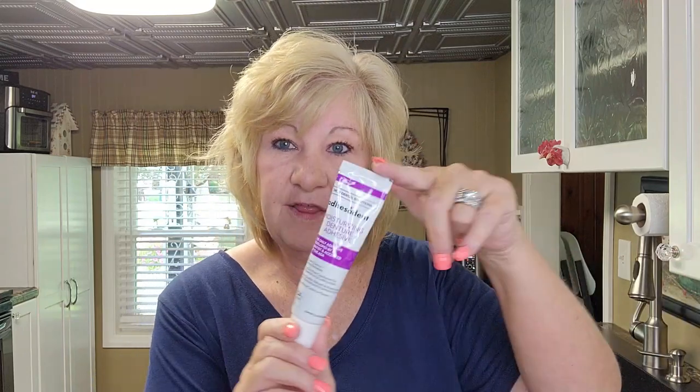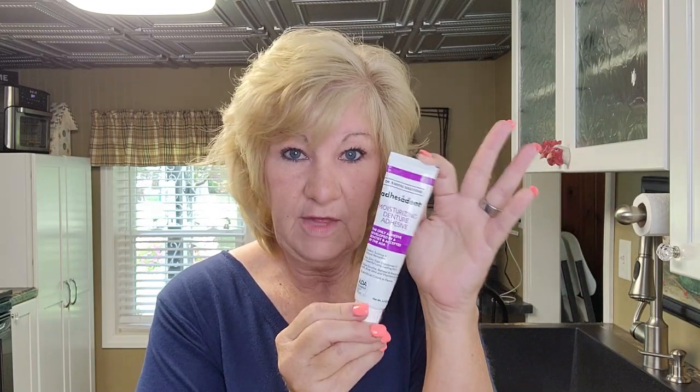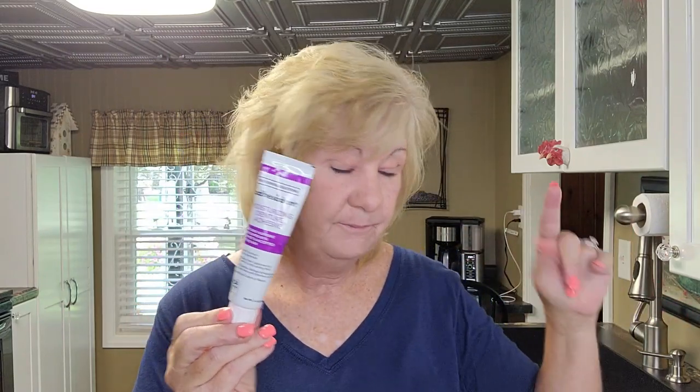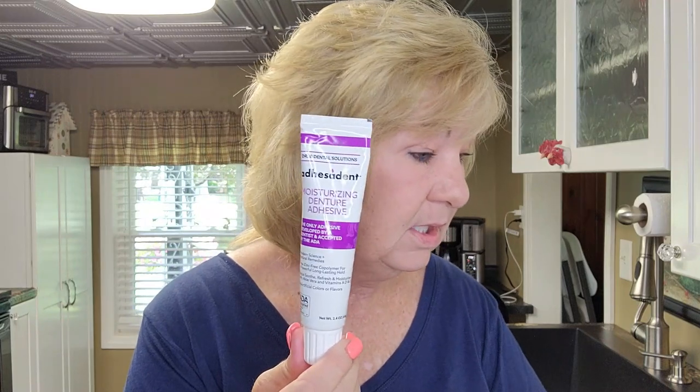This is how I got the Dr. B adhesive to work for me. Do I like it now? Yes, because I took the time to work with it — I used a lot, then a little, then less — and I applied techniques from other denture adhesive reviews. I have a very dry mouth; I take medication four times a day and two of them cause dry mouth as a side effect. Using this, my mouth wasn't so dry throughout the day. It works.